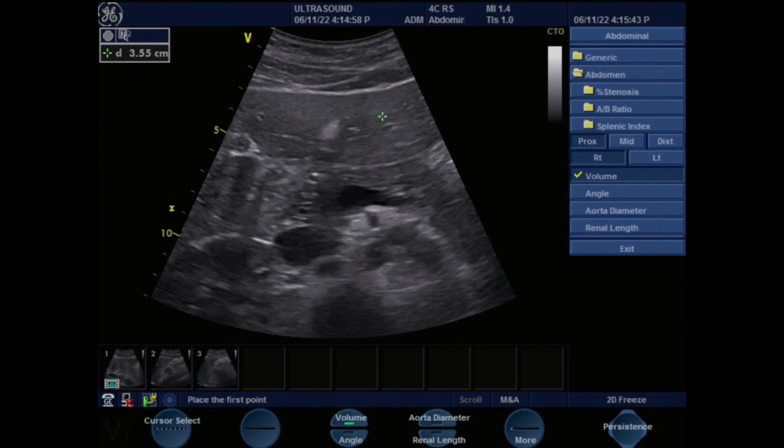That's like if you want to run an elastography, or if I look at a scan that measures the liver fibrosis, but it's just eyeballing and comparing it to the rest of the organs, especially to the kidney cortex. And then if you want to do the gallbladder, they use the same probes for fibrosis. We use the same for an elastography, yes.